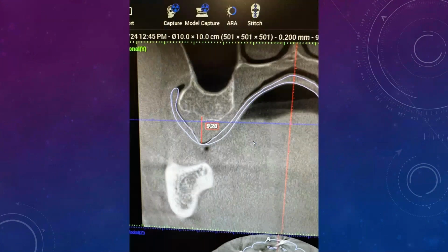So when we talked about biologic width a little bit earlier, right? We measure how much gingiva we have, and we measure from bone levels and stuff like this. This particular case patient had Kelly combination syndrome, and usually with Kelly combination syndrome, you're going to end up with hanging tuberosities, because what basically happens is you have a full upper denture, and you have a lower partially dentate arch, canine to canine, usually with a lower partial.